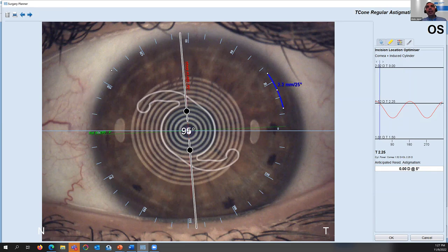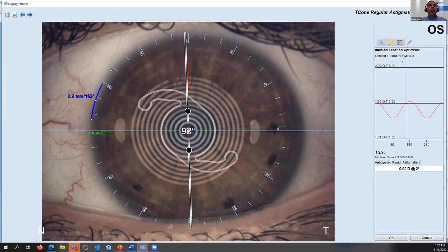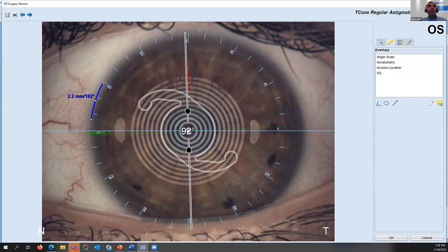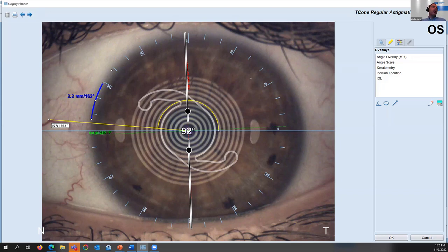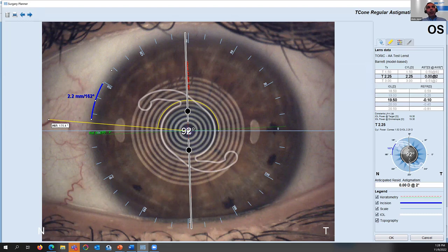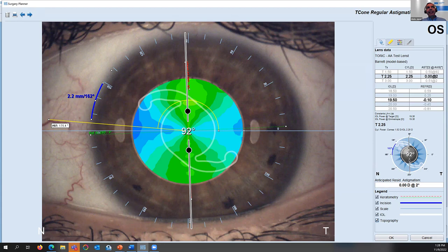One last feature: we need a landmark. If a blood vessel is well recognized by the surgeon, we can add an angle and click on it — for example, a vessel at 175.5 degrees. When the surgeon goes to the OR, they can mark this at 175 degrees and proceed accordingly. You can also overlay the topography on top of the eye image to easily validate that the toric axis is on the steep axis.